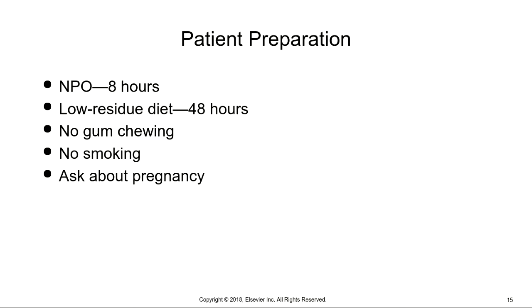They talk about that the goal of patient prep for the small bowel is basically an empty stomach. So you typically withhold food and fluid for at least 8 hours prior to that exam, and ideally a low residue diet should be followed. Low residue meaning you don't want anything that's going to stay in there long periods of time. And as always, we ask about pregnancy if that is a potential.